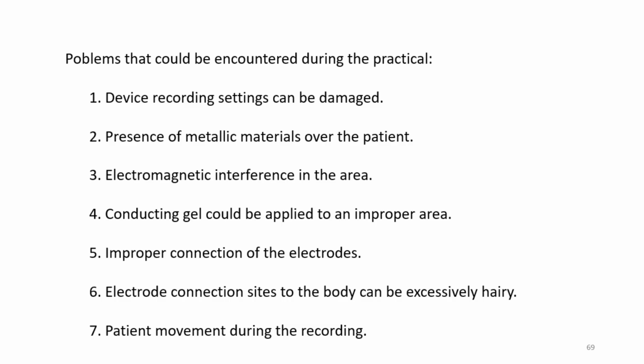If conducting gel is not applied properly, electrical conductance can be disturbed. Improper connection of the electrodes: if there is a problem with connection, you cannot record properly. Electrode connection sites on the body may be very hairy. If there is so much hair on the body, it may be difficult to record, especially on the chest. And patient movement during recording can cause artifacts.